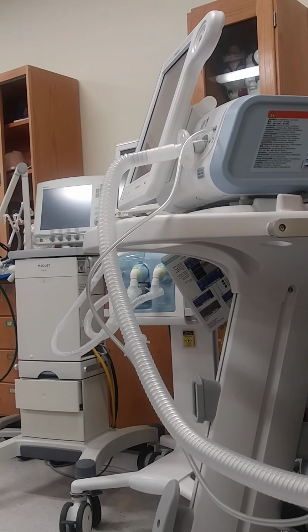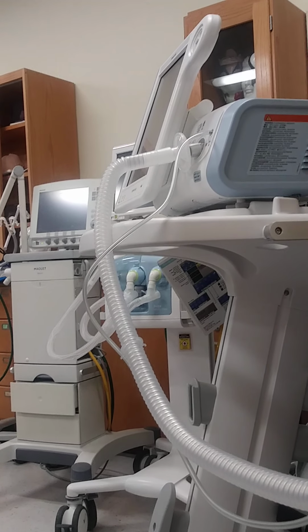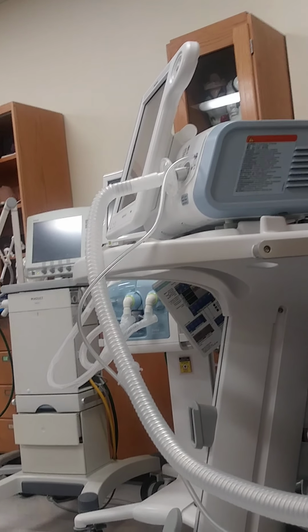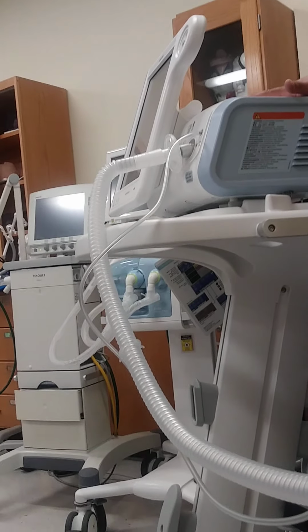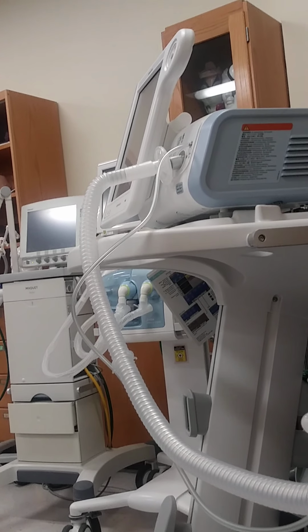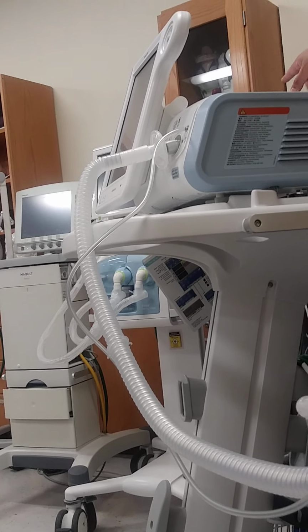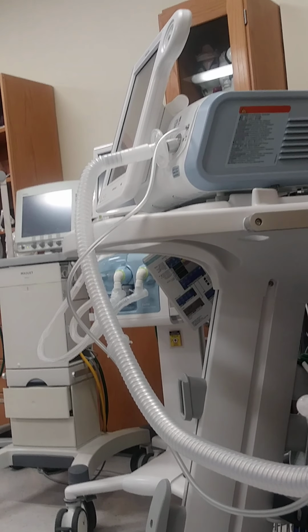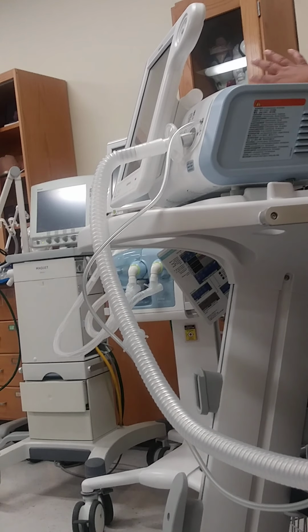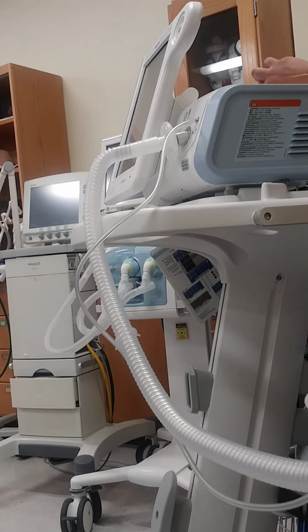somebody overdosed on something, or what if they got really drunk and they just like knocked out? Then they're going to have a hard time maintaining that volume because their breathing slows down and their oxygen levels drop. So that's when these types of things come in and we help replace that. Okay? So we give them a volume and we can also help them with the respiratory rate. Okay? A ventilator is life support. It does all that for them. This kind of helps them. It's like a trainer where you're helping them, okay? But a ventilator, we take full control of that because we sedate them and then we let the ventilator do all the breathing. Okay?